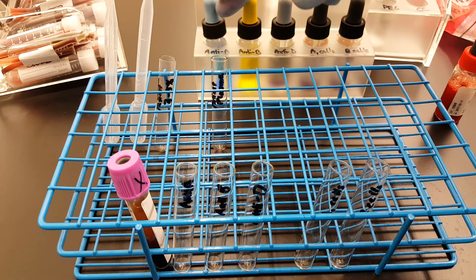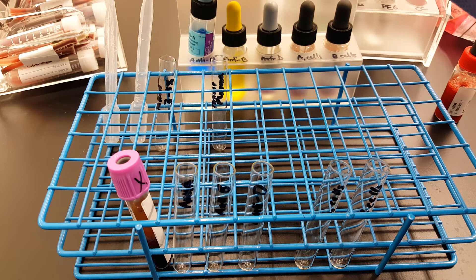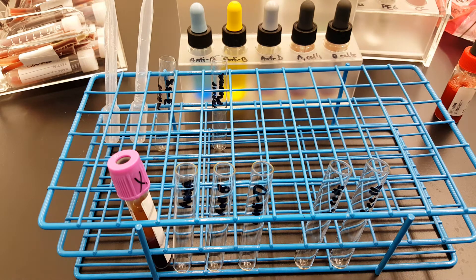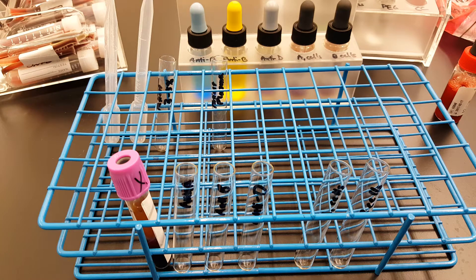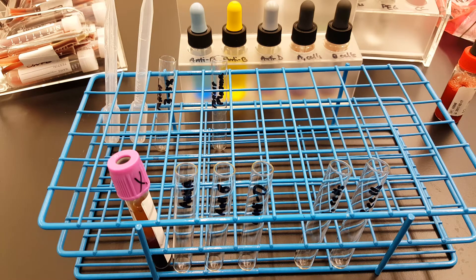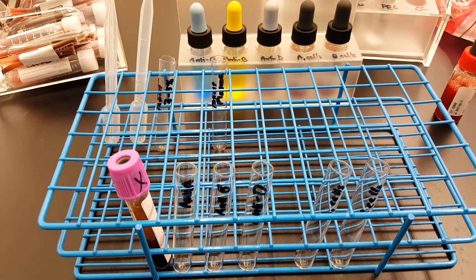These three up on the left are called the forward typing. We have the anti-A, the anti-B, and the anti-D. These are called forward typing because they have antibodies in them that are going to bind to any antigen protein on the patient's red cells if they're present, and that would cause agglutination. When we look at the forward typing, that is the reaction we're thinking of when we're trying to identify the person's blood type.